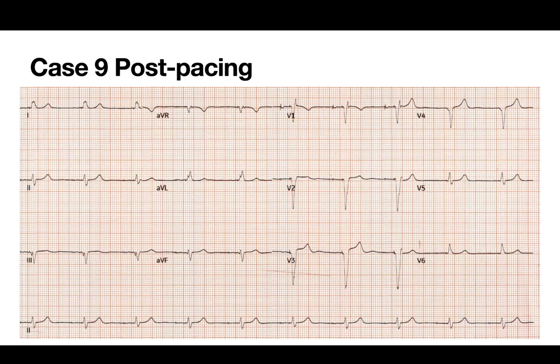But if impedance is fine and injury current is still positive, it's a nice result. I think the lead is stable. The fulcrum sign says I'm probably deep enough. I would probably stop, but I don't know what the other ones are.